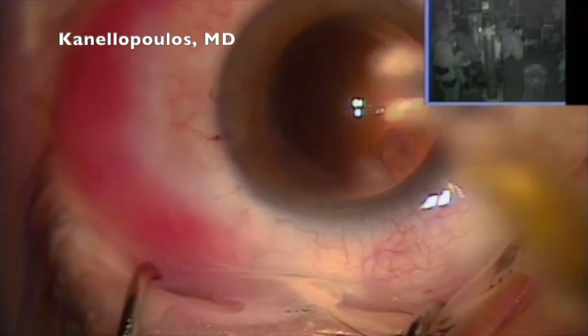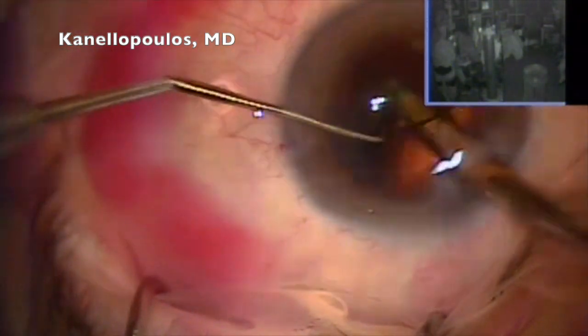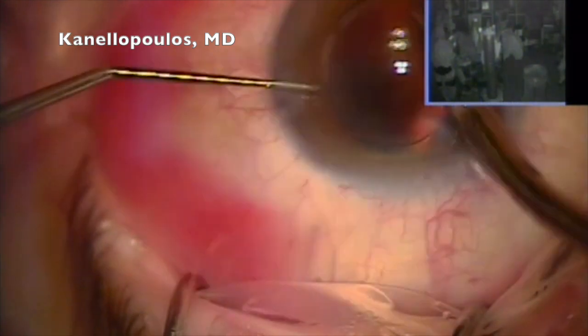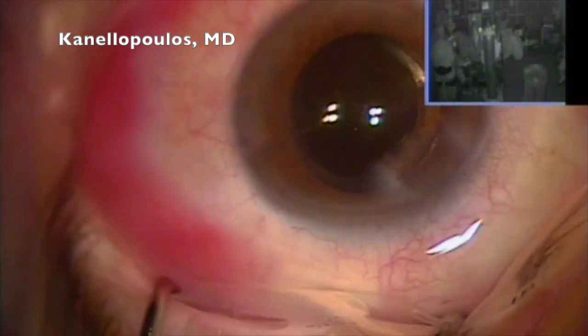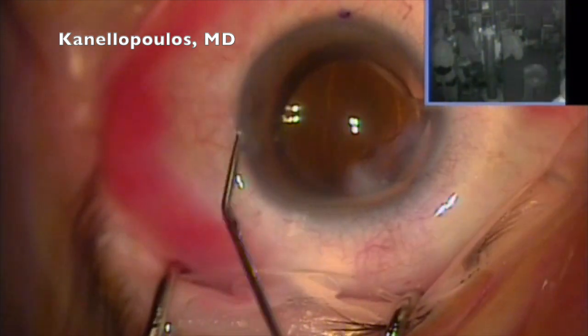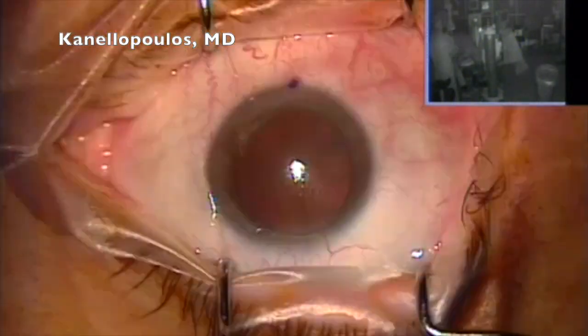We're documenting the lens. In Greece, there's a big milieu and spectrum of lenses, so we want to always document that we're using the premier lens — toric intraocular lens. And I think we hold the world record: 95% of our cataract surgery cases we use a toric intraocular lens, the AcrySof Aspheric.